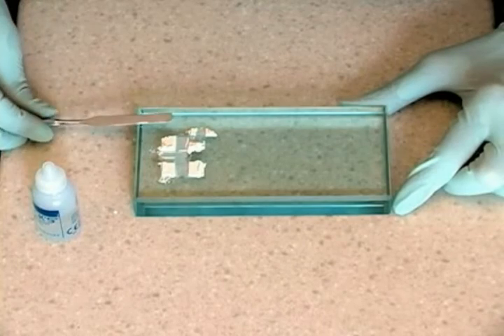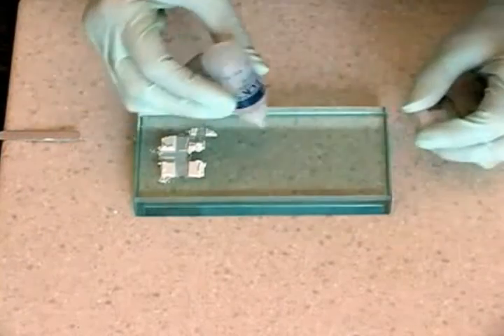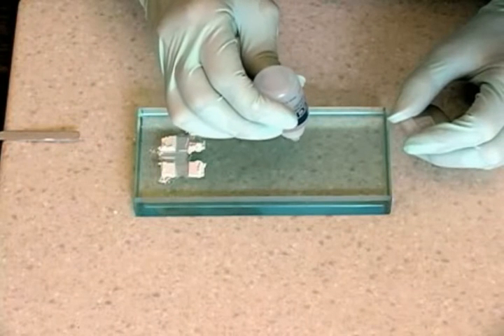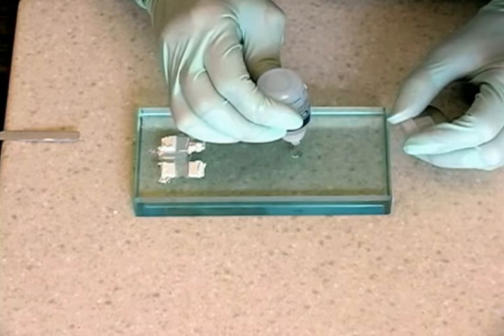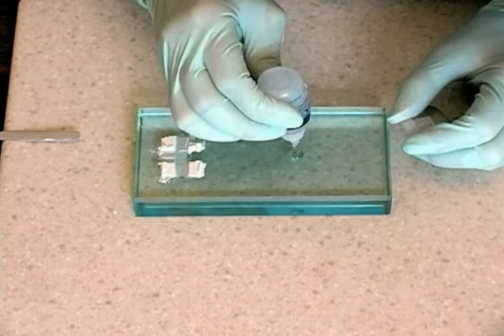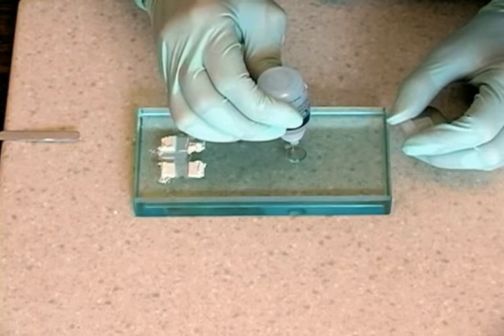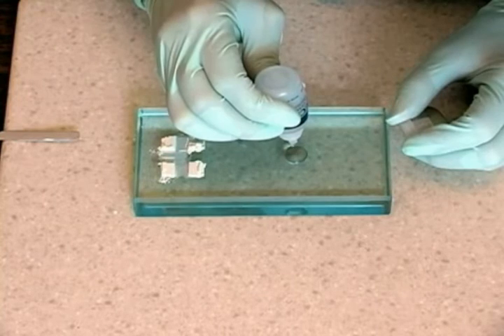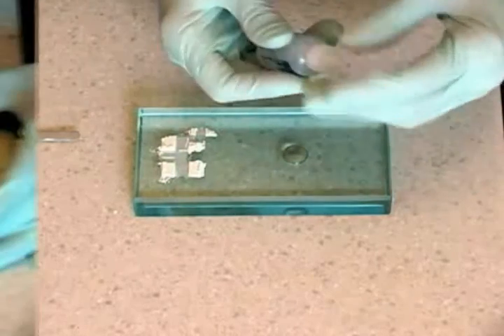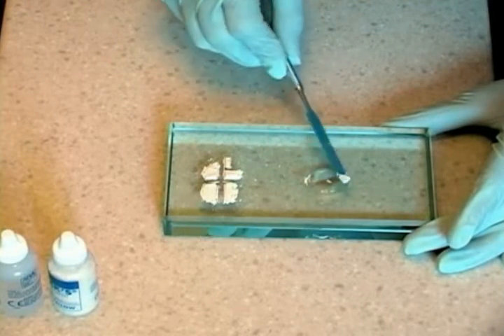Hold the liquid bottle perpendicular to the opposite end of the slab and dispense twelve drops. Replace the cap on the liquid bottle. Mix the smallest portions first.